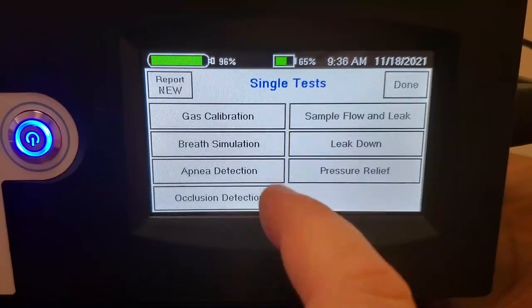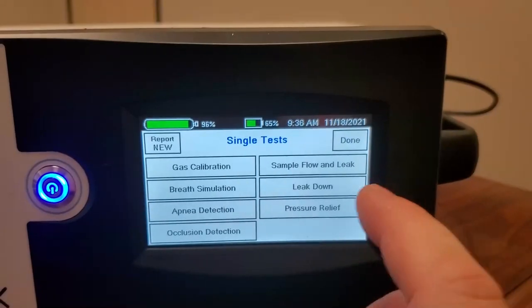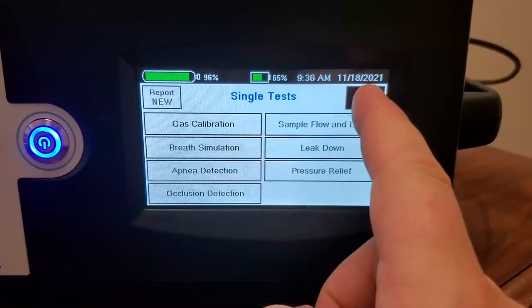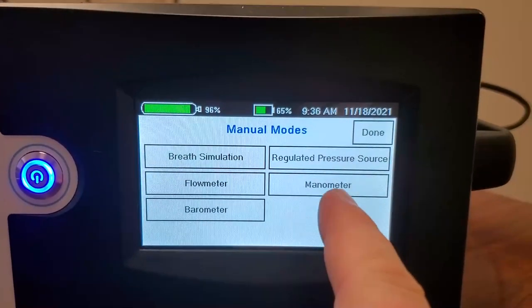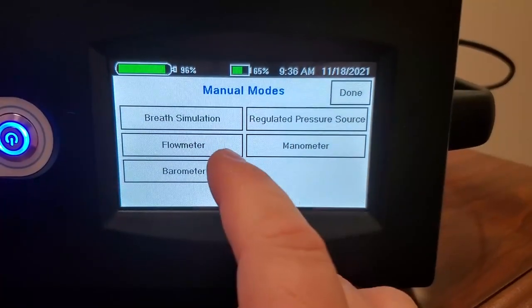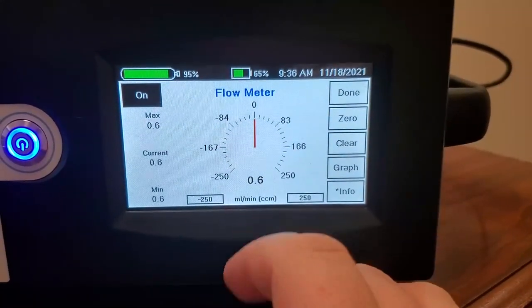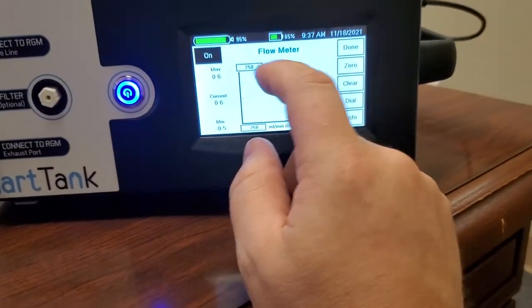I really dig the sample flow and leak test — although I use GE modules, it's mainly useful for non-GE modules. For other types of capnography devices it works awesome. I also showed the manual modes — it's got a manometer built in, which I'd use with the pressure port. The flow meter is also really cool, and you can actually set your alarms by touching them on screen, which is very cool. There's a lot of stuff you can do in here — it would take a whole class to go through, and everything is customizable.